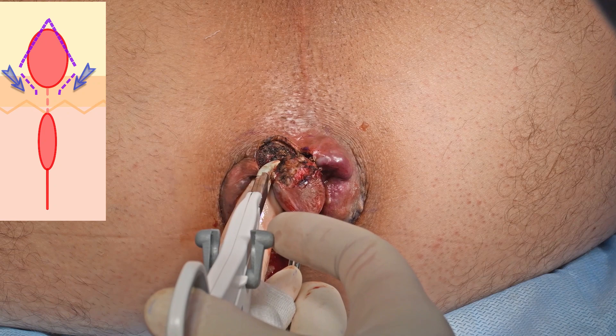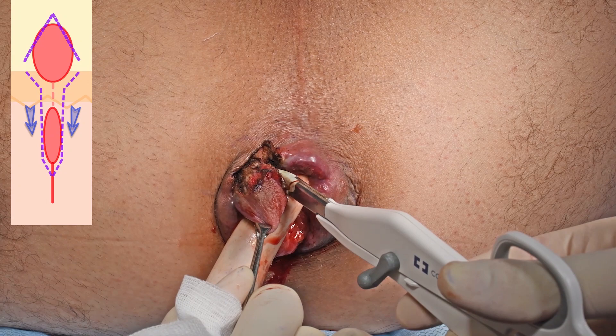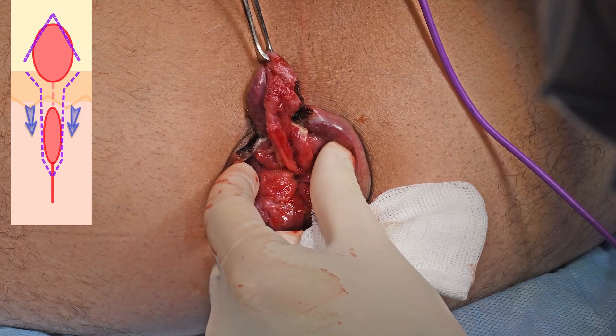Extra care is taken to ensure that the internal sphincter muscles are left intact. With the jaws of the device applied perpendicular, the pedicle is divided.